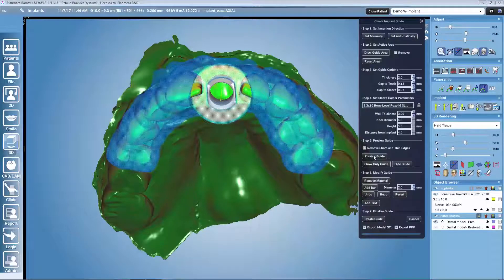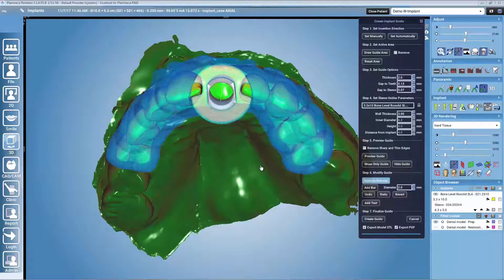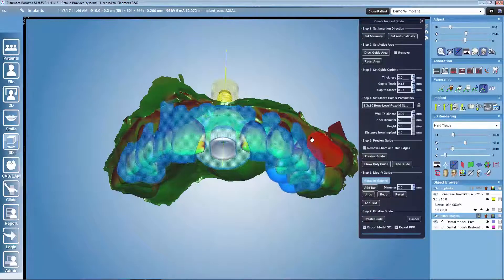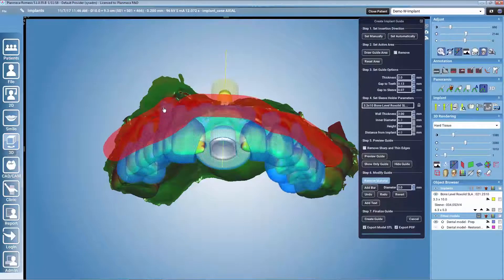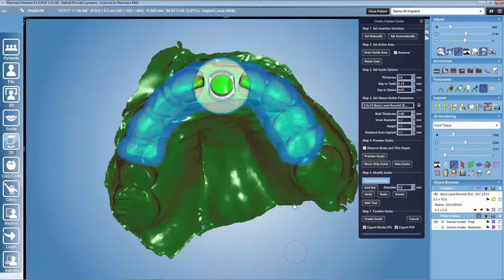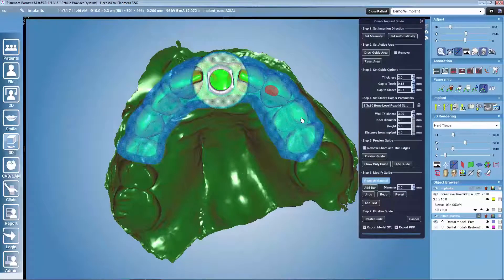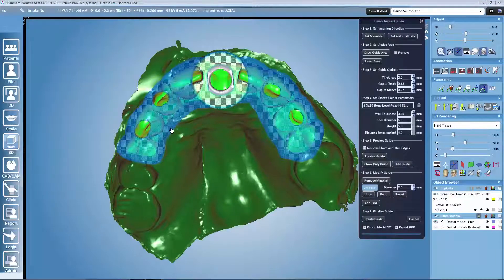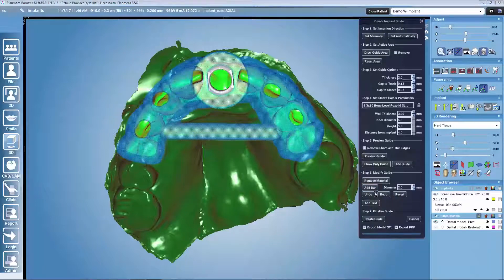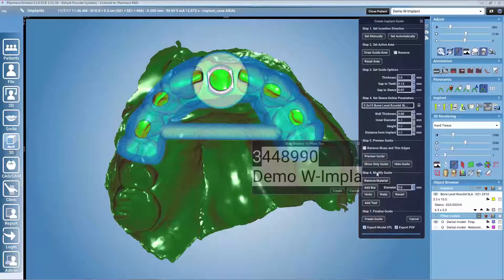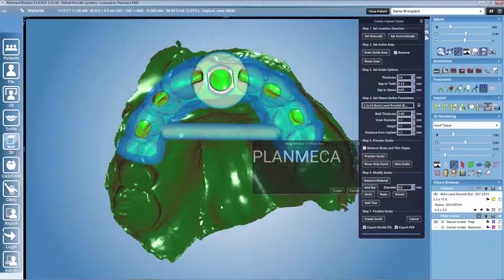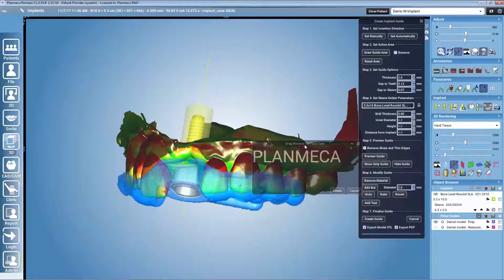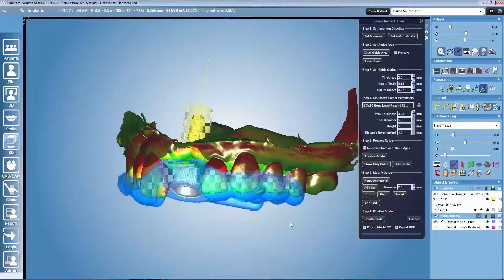Romexis will calculate a preview of the guide which we can then still modify. For example, we can remove material — if there are unnecessary parts we want to remove from the actual guide. We may also add inspection windows wherever we wish them to be. We can add a bar if we need more strength in the guide, and we can also add a text label by rotating the model and placing it on top of the guide where we want the text. We can also view the guide alone to check if we are happy with the design.